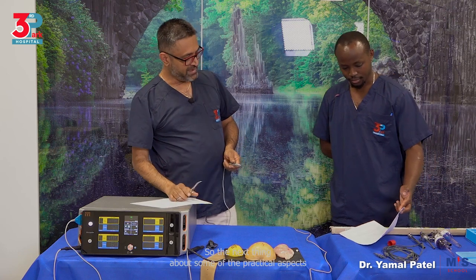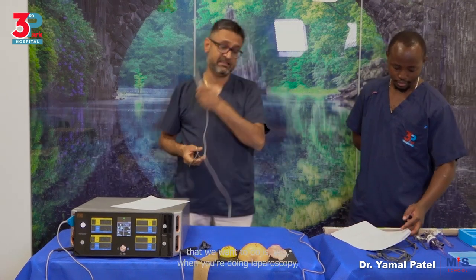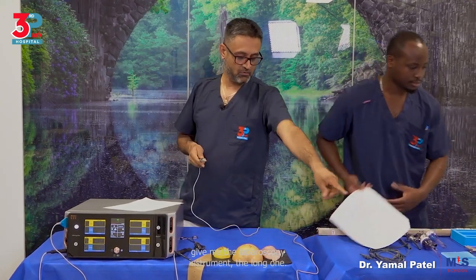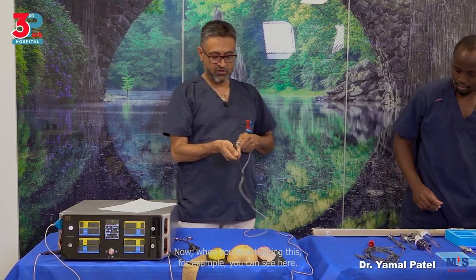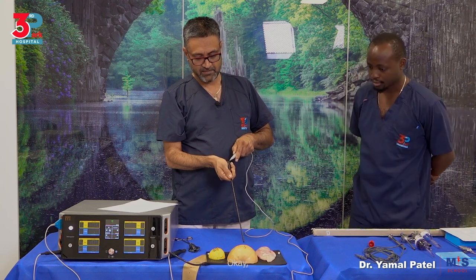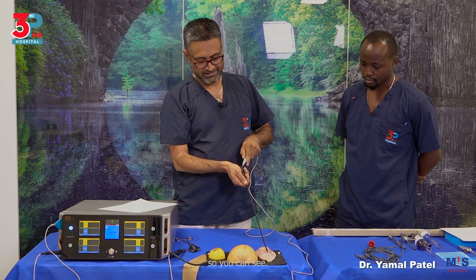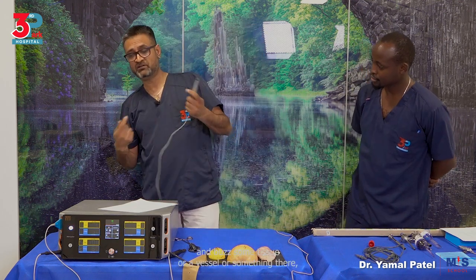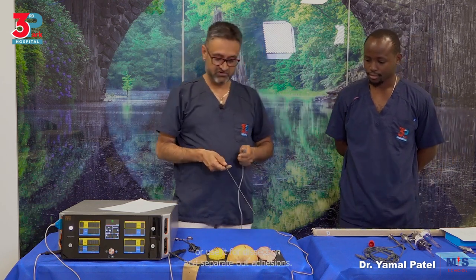Okay, so the next thing about some of the practical aspects that we want to do is, yes, when you're doing laparoscopy, give me the laparoscopy instrument, the long one. When you're doing laparoscopy now, when you're activating this, for example, you can see here, okay? So you can see. So that's laparoscopy, where you want to go and buzz some tissue or a vessel or something there, or use it for dissection and separate out adhesions.